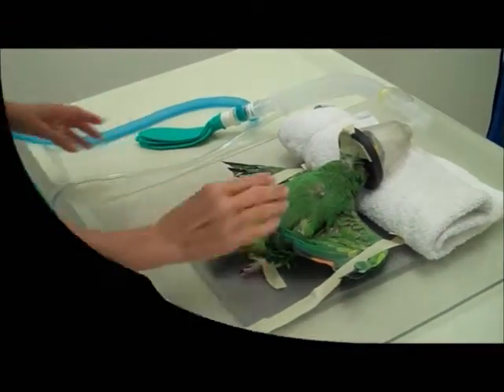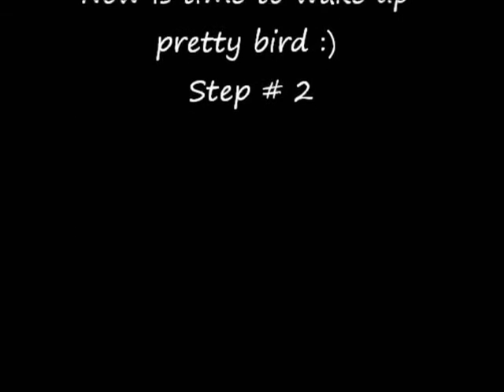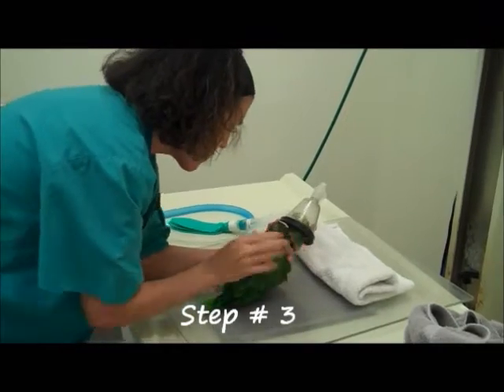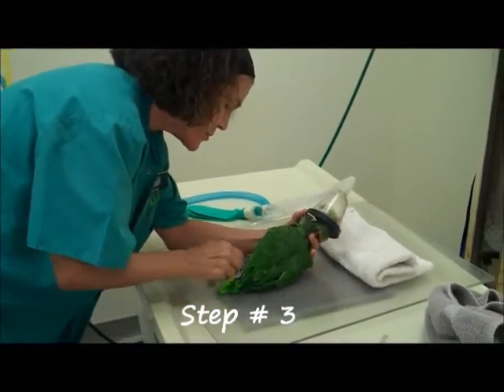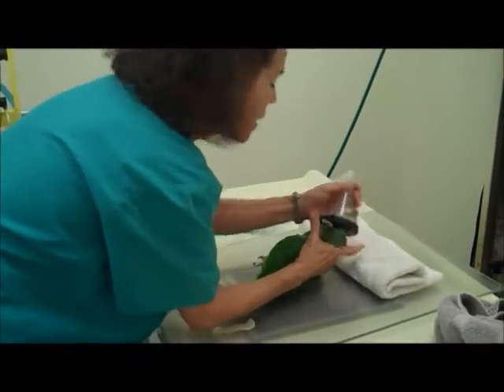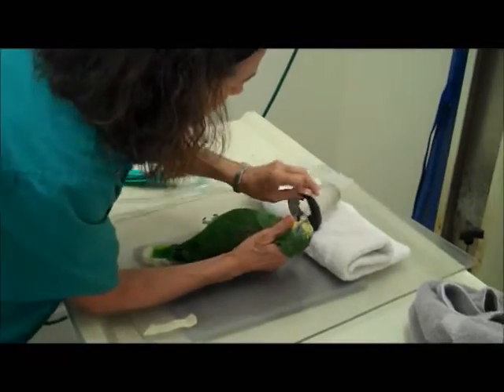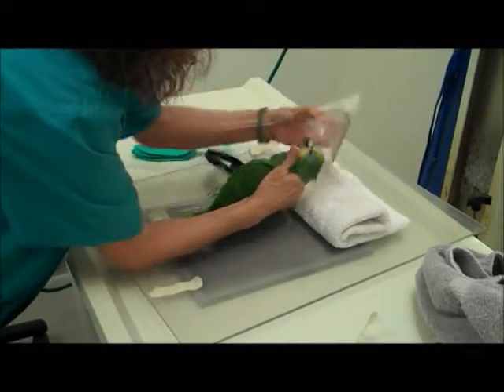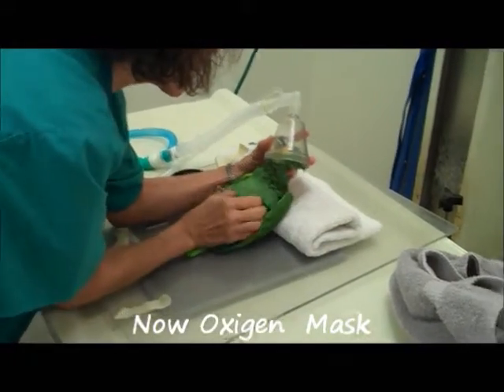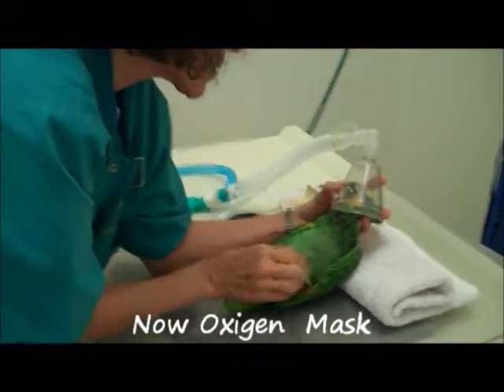Now we're going to get out of the way. I'm raising him up into a high posture. I want to clear the lines. Giving pure oxygen, bringing him back a little quicker. Since breathing was his problem, now pure oxygen is good.